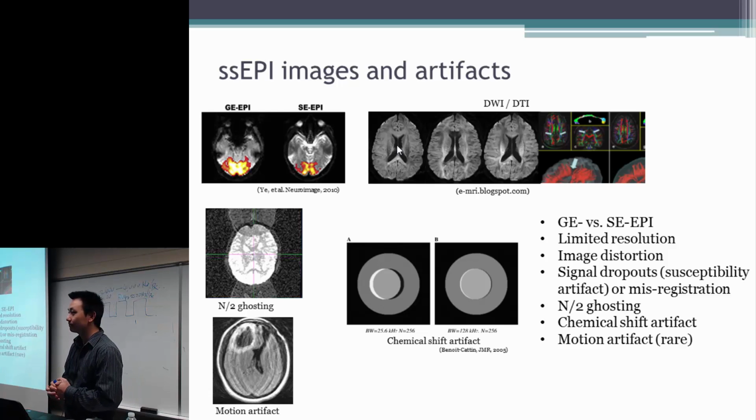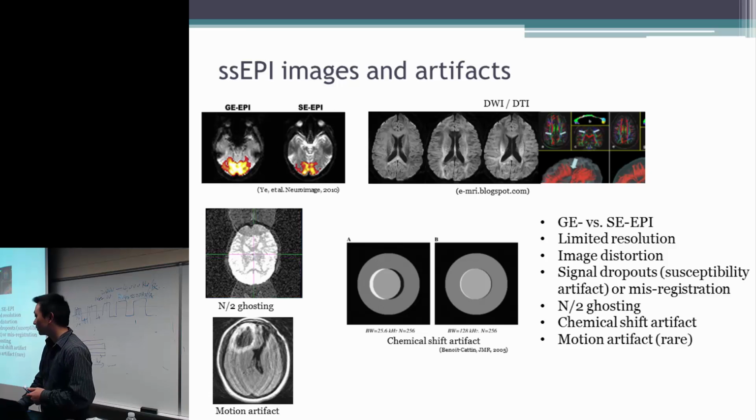One of our homework problems, pretty much unrelated to this, said that if you had a very fine, narrow radio frequency pulse, you could just excite fat or water. Then there was a problem where silicone was added to the fat and the water, and what you wanted to do was null fat and water to get an image of silicone. If you couldn't have these fine pulses, why not just excite silicone to begin with?